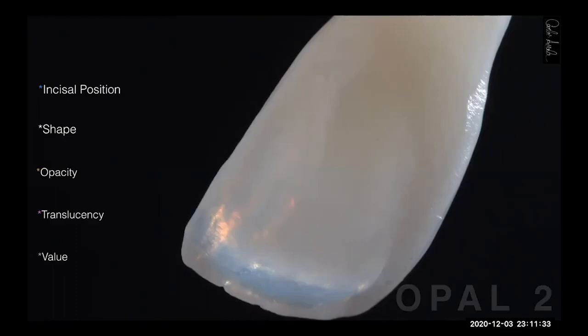And value, why value? Because normally we technicians love to use too much enamels, too much opals, too much translucency. And sometimes we change the value, because we can control that sometimes. And sometimes we don't think that the concavity of the mouth is dark. So sometimes we see a nice crown in the model, but when we go to the mouth, everything looks grayish. It's because we use too much translucency, too much enamels. So one of the ways to control the value of the restoration is doing that technique, okay?